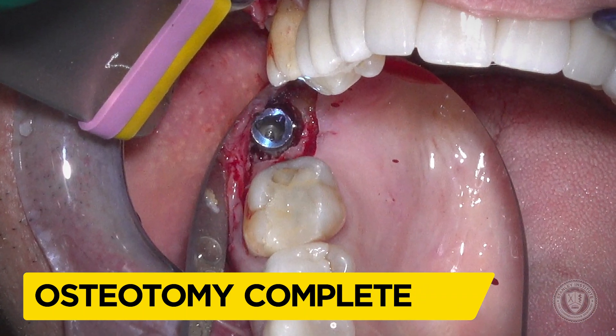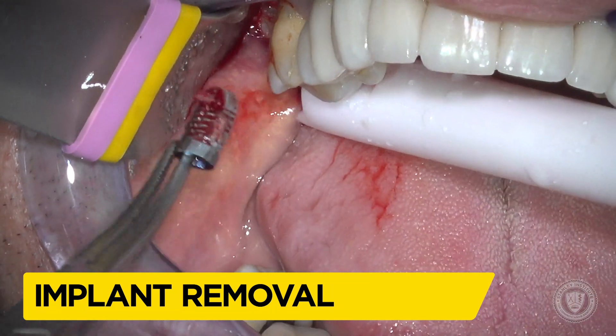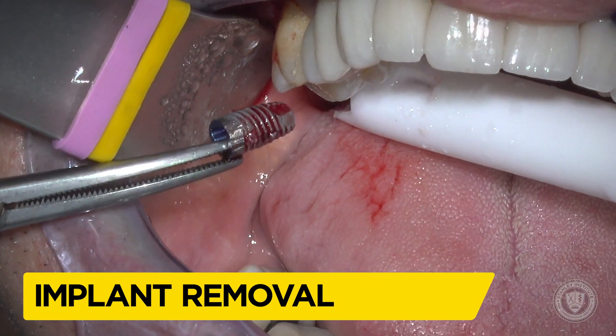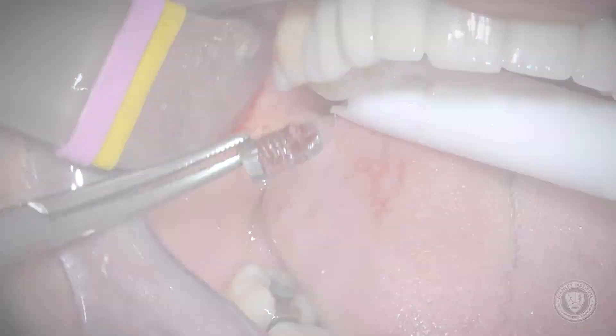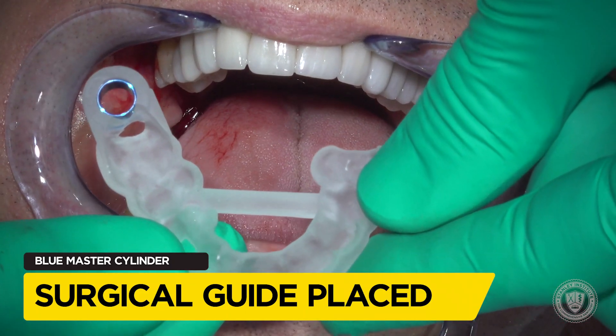We troughed around the outside of the implant and we're going to retrieve it. You might be thinking we're going to graft this and let it heal, but that's not the case. This implant was so far off from its position that we believed we could do a guided surgery and place the implant in the idealized location all in one appointment.